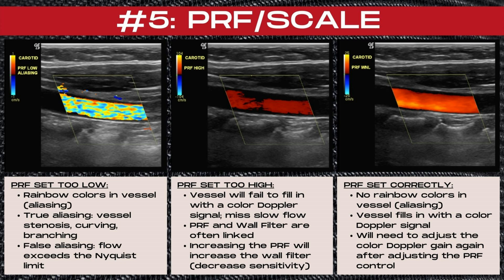True aliasing is caused by vessel stenosis, curving, branching, or turbulence. False aliasing occurs when flow exceeds the Nyquist limit or angles over 60 degrees are used. In the middle image, the PRF is set too high — the vessel fails to fill in with a color Doppler signal, and this can also miss slow flow states. It's important to note that the PRF and wall filter are often linked on many ultrasound machines, so increasing the PRF also increases the wall filter, which decreases Doppler sensitivity. In the image to the far right, the PRF is set correctly — there are no rainbow colors within the vessel and the vessel is filling in with a color Doppler signal. Note that you'll need to adjust the color Doppler gain again after adjusting the PRF control.